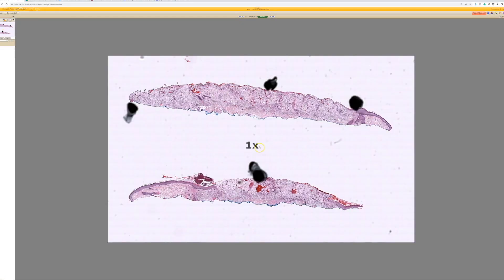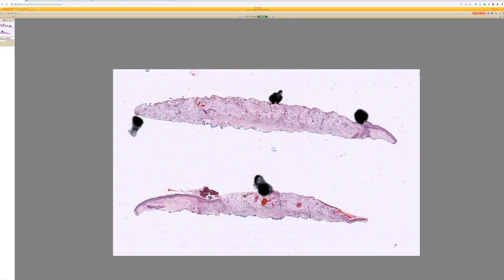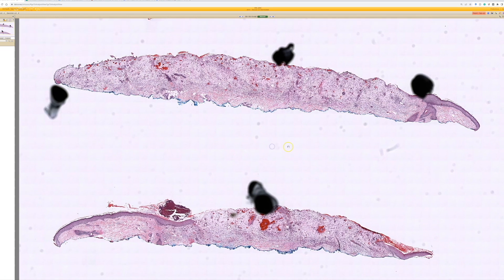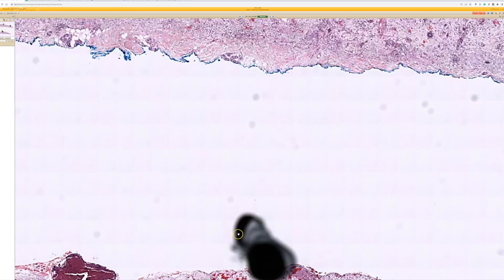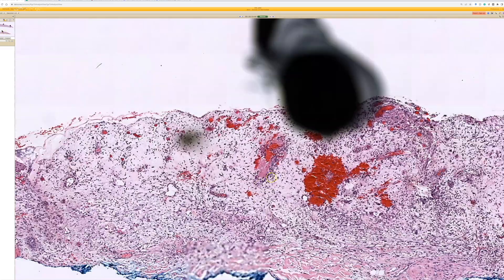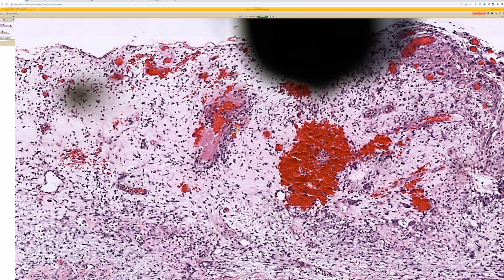Number 15 — thankfully we've got a dot sign to help us here. The dot sign is very valuable. Basically, to cut to the chase: inflamed ulcer with a lot of edema and granulation tissue. And then what do we see at the dot sign?